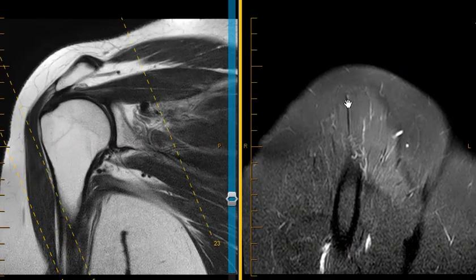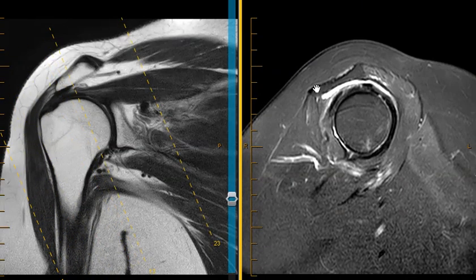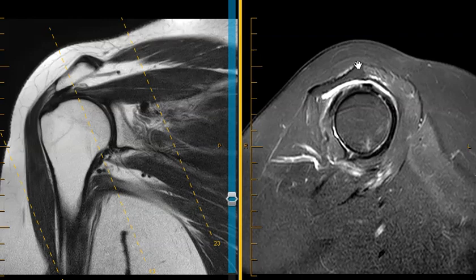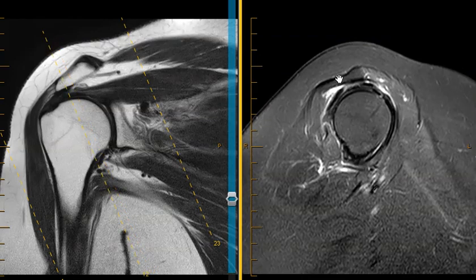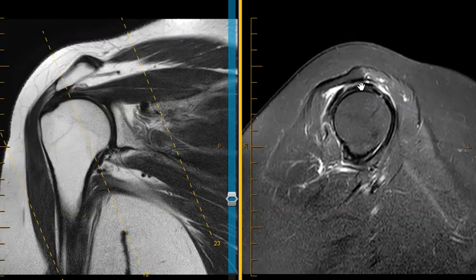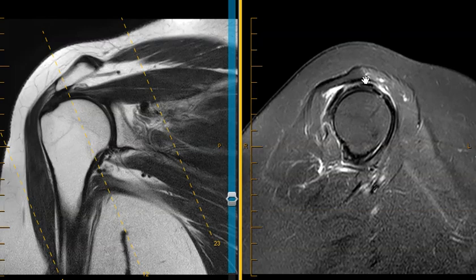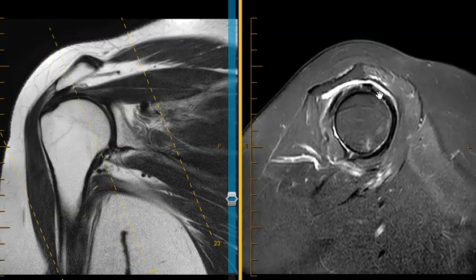Now, if we put up another view from a different angle, we can see the acromion process here. Normally the acromion will parallel the round humeral head — it should be more parallel to it — but instead it's tilted towards it, pointed downwards. We call this a positive slope. If it was perfectly parallel, we call it neutral, but when it angles down like this, it's a positive slope, and that abnormal sloping can also predispose to impingement.